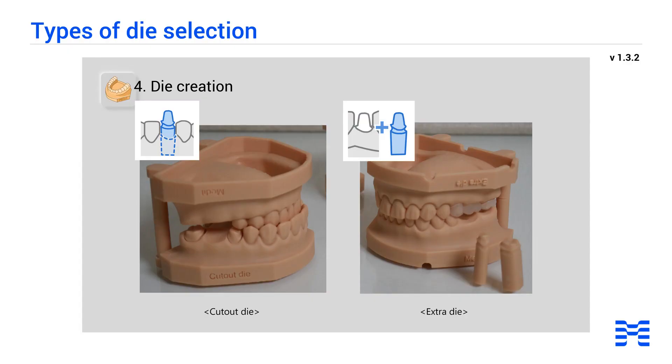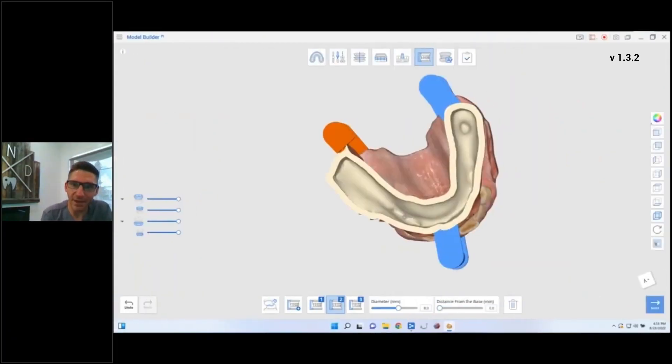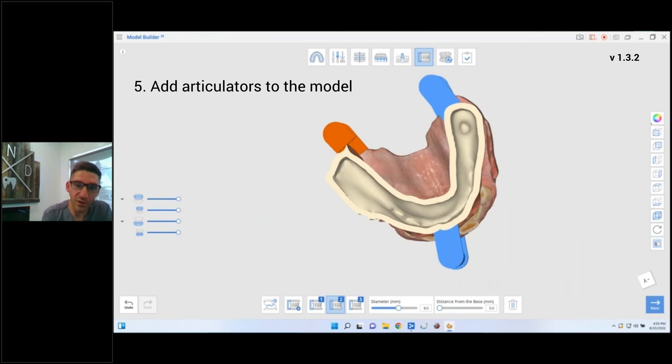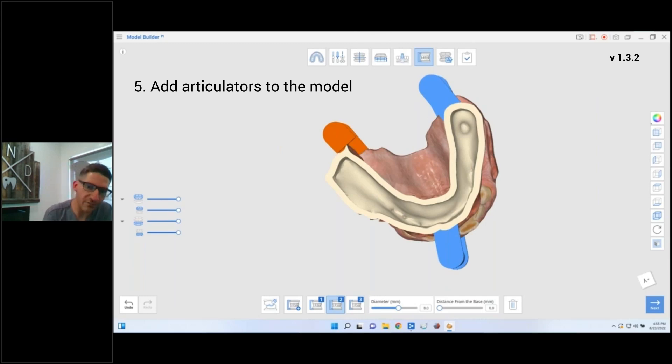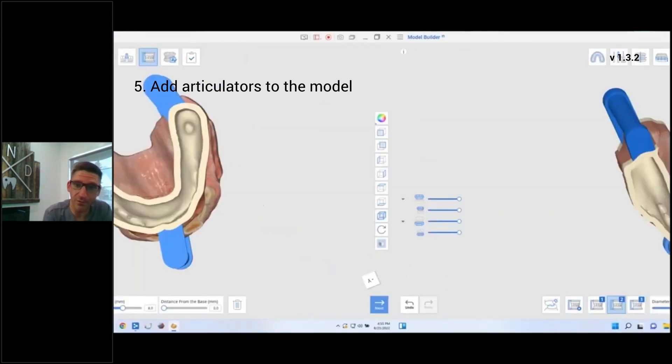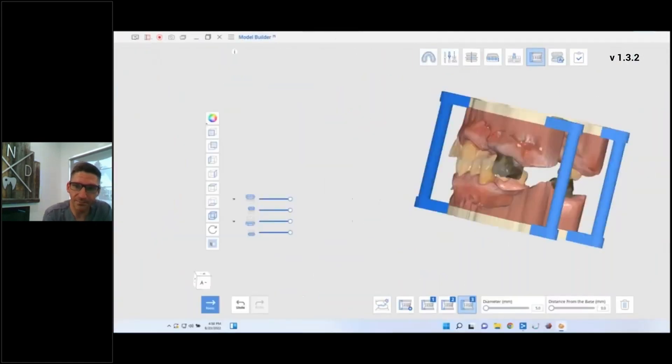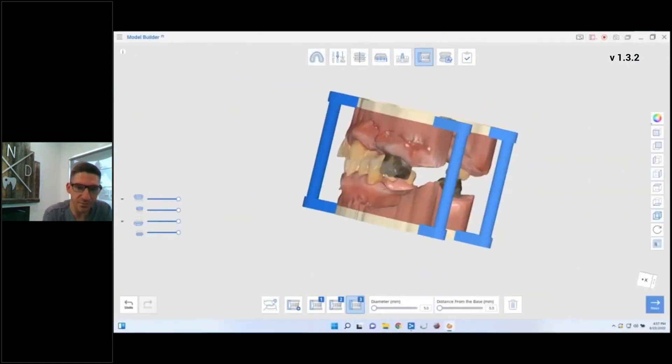So there we go, we have our initial, this is what our models are going to look like. Again, this is the step where if you're doing crown and bridge, you need to make removable dies. Do you want to have your articulation pins? So again, are you going to mount this case? Do you have a bite, do you need a bite? You can add pins, you can remove pins, you can change the size. If it's orange that means it's not in a proper spot, so you just need to move it a little bit till it goes blue. There we go. Again, super simple.